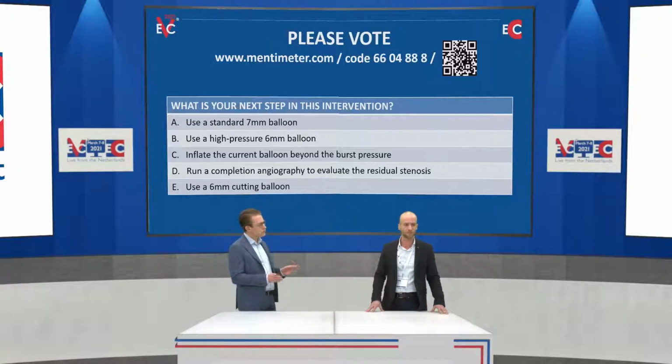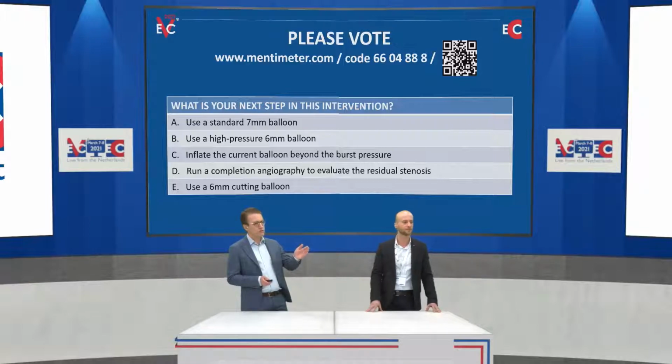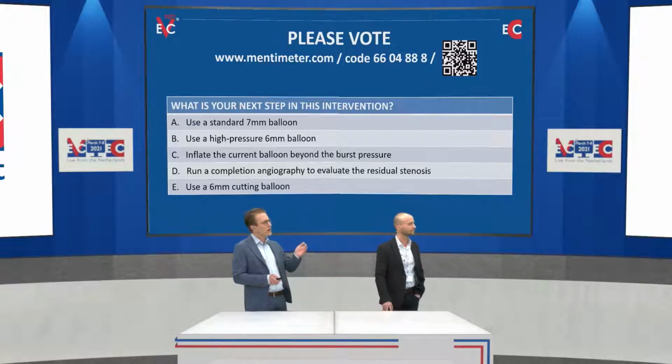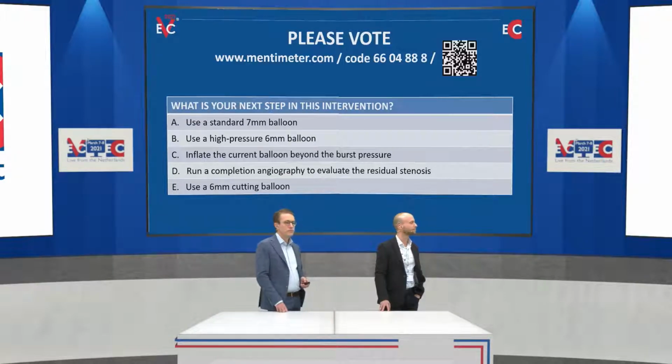So for a good result, the balloon should definitely be fully open. Yes. And how can we achieve this? I think Dr. Tozzi already told us that he would generally go for high pressure balloons, even as a first step. Is there any room for a cutting balloon, in your opinion, Matteo?